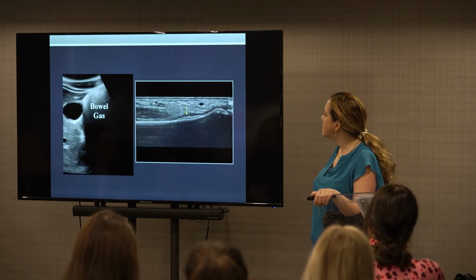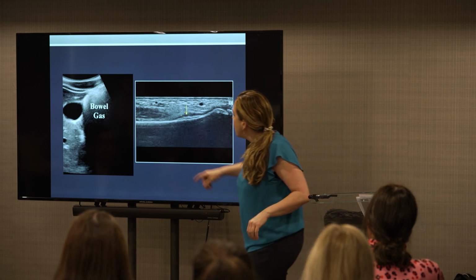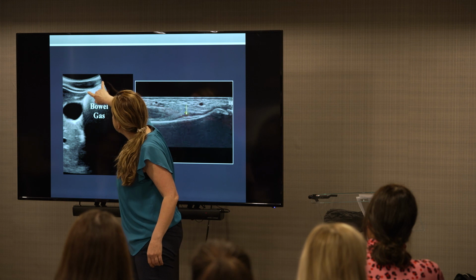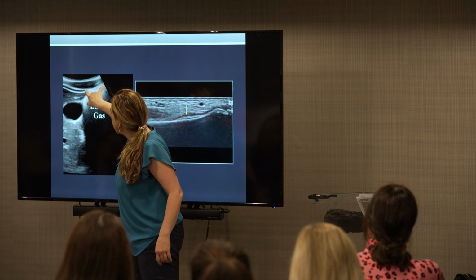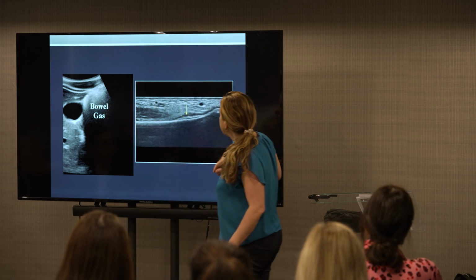Next slide. So this is bowel gas. This is just things I've pinched off the internet. But this is bowel gas. This will be an abdomen. So you can see deep to this bowel gas, you can't get any information. It's just a shadow. So bowel gas, not cool.